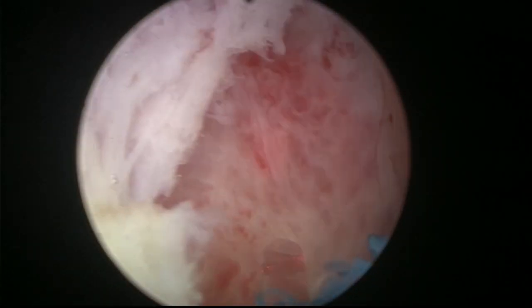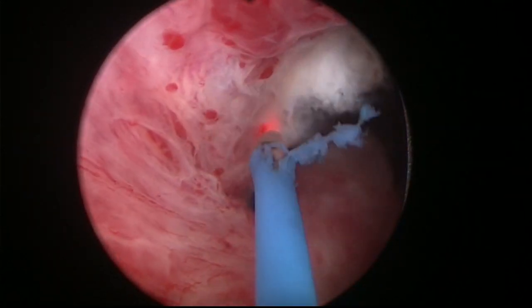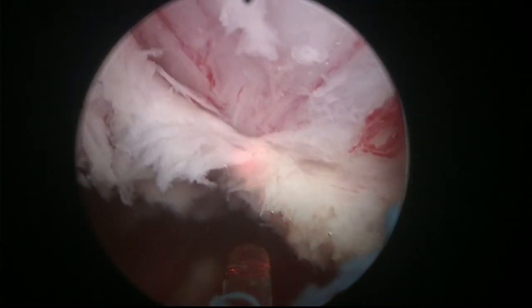I have to agree that the classic technique is quite well known. Look at the apex — the sphincter's mucosa is perfectly preserved. We preserved everything, and this is the important aspect. Now we have the other lobe. This is 12 o'clock, and we have the white line.